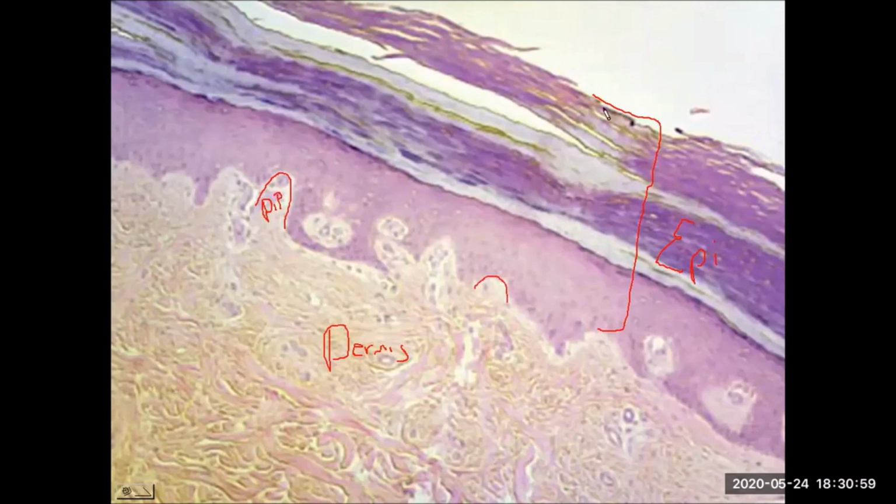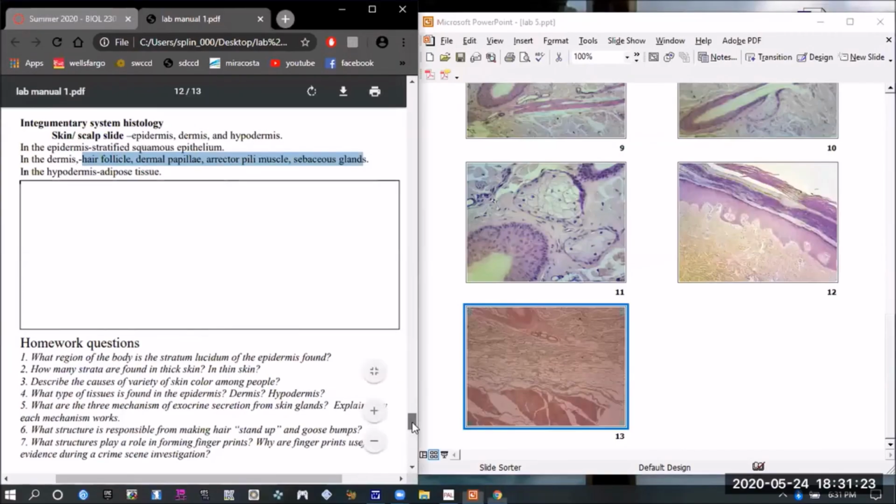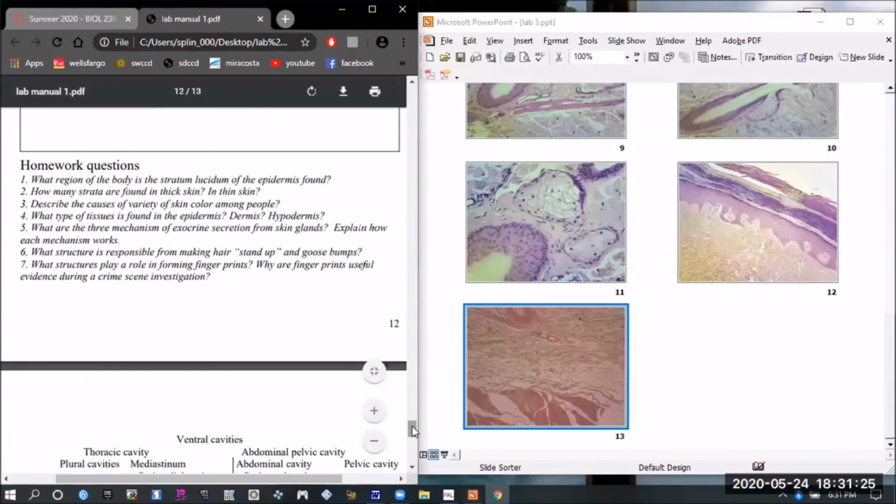So now we're ready to transition from the dermal layer. And again, you can start to see the adipose tissue. And we know we're in the hypodermis, so that underlying cushion of adipose tissue. And even deep to that, we're starting to see now some muscle. So that's our histology, and that finishes up our Lab 5 and this first unit of the course.